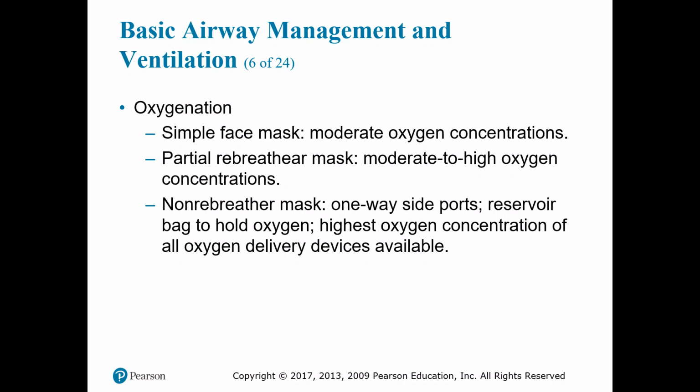These devices are rarely carried by EMS anymore, but you may see them on a transfer. This is an ER thing, or a small hospital where they might put them on. You may see them in nursing homes. Nursing homes like to put them on with a concentrator, is where I've seen them a lot. You'll see all kinds of things with these. I've seen people cut out the sides because the patient stated they couldn't breathe, so they cut the sides of the mask out and hooked it up to 5 liters per concentrator. So you'll see some interesting things out there.